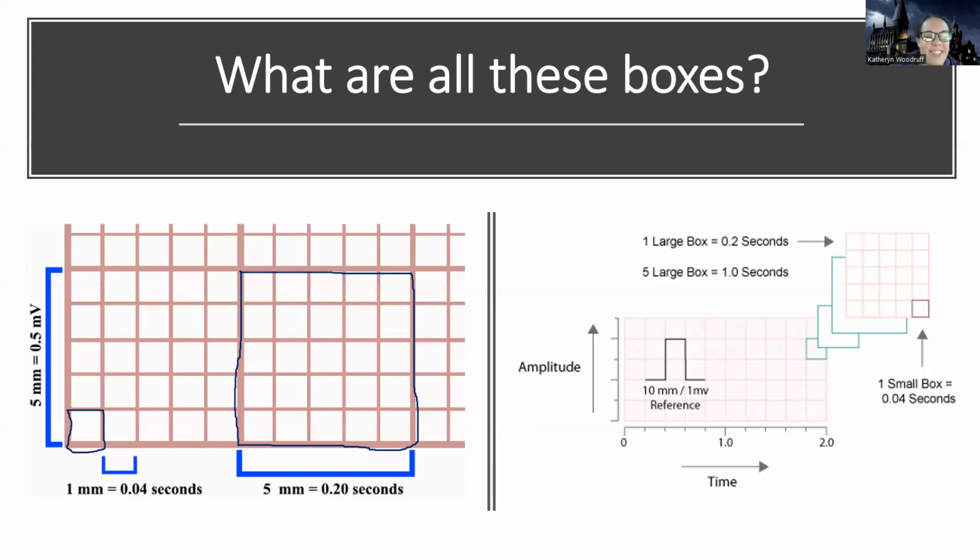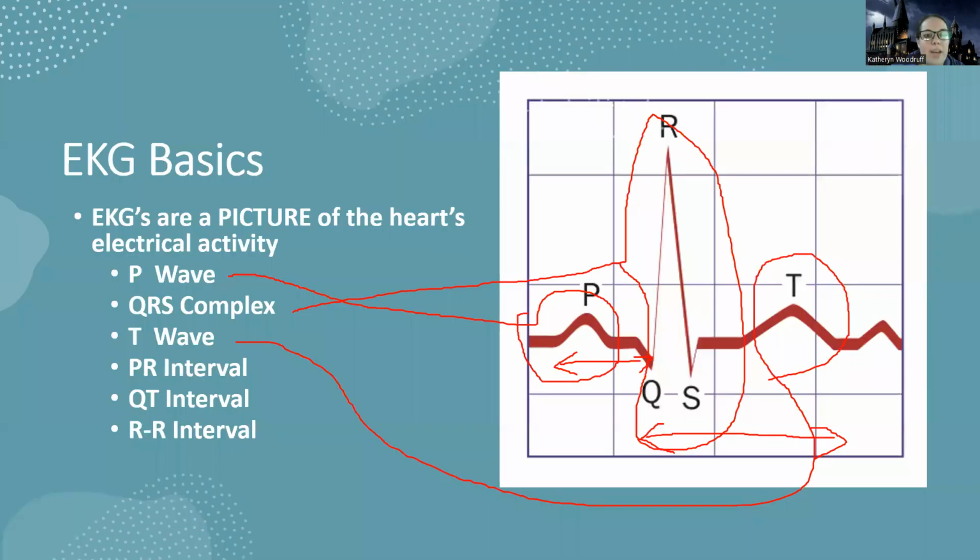So effectively, so far, to sum up, and hopefully to get back to some sanity, because I feel like it's so hard to teach this without going deep, and just showing an introduction. So give me a little grace and please keep listening, because I promise it gets better. But so far, I want you just to understand that there are parts to the EKG, and that each of them represents a different part of the electrical system in the heart, and different messages that are getting sent in the heart and tell me how my heart's electrical activity is doing.